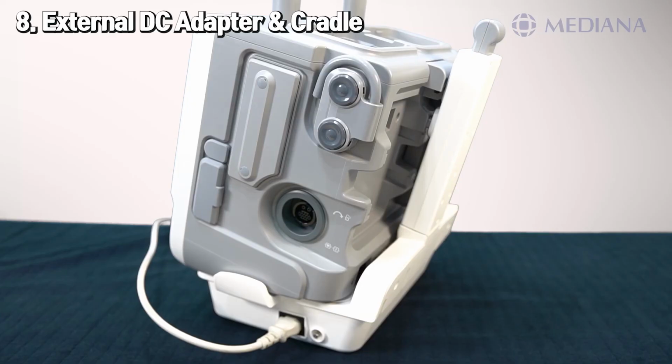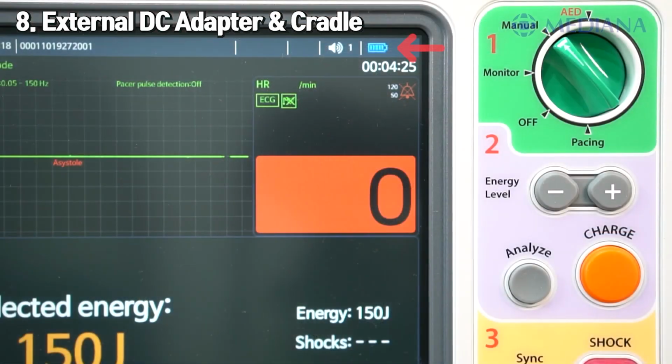The external DC power source can be a big help when transporting a patient to the hospital in an emergency case. Even though the dual batteries provide 5 hours of operating time each, there can be a case when you don't have enough power to support and you may need to recharge the battery. Putting the device together, you can verify that the DC power input icon appears on the screen. Battery charging status is shown on the front panel of the device.